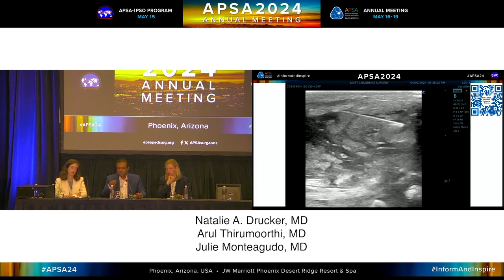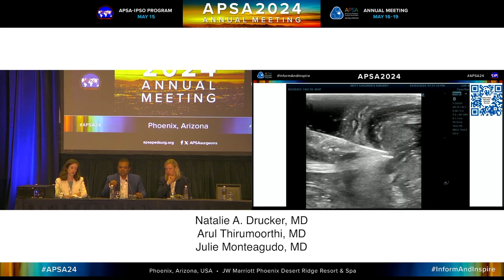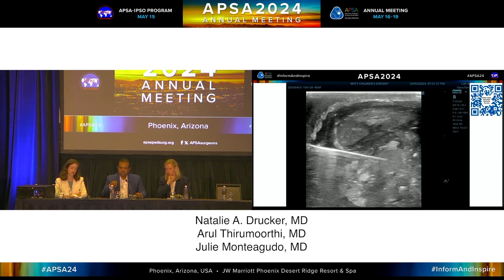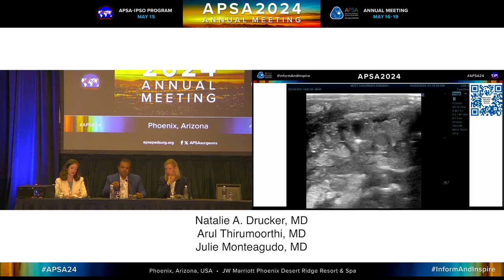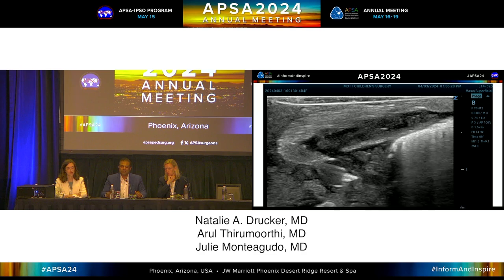This is going further needle into the vein. And there we go. You can see the tip of the needle in there. And I'm trying to advance it. So right here in the bottom left, you can see the needle in the vein again. I know this is all a little bit distorted. There we go. That's probably the best example. This is what I was looking for right there.